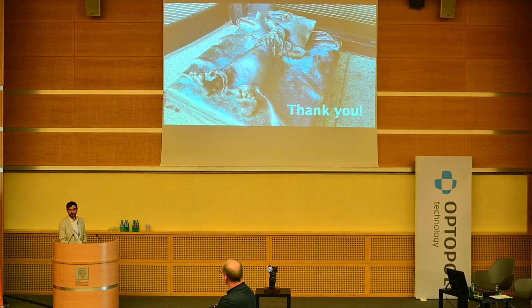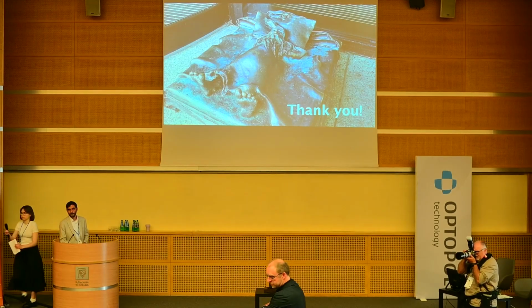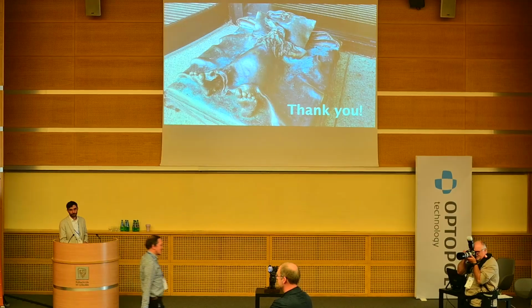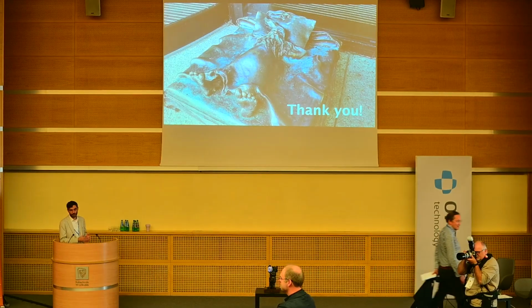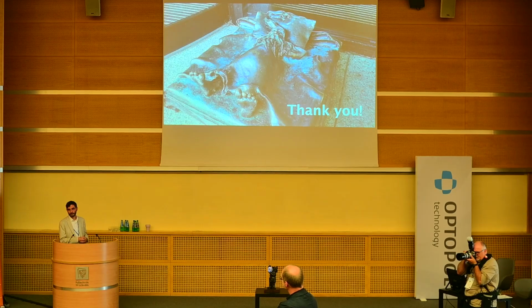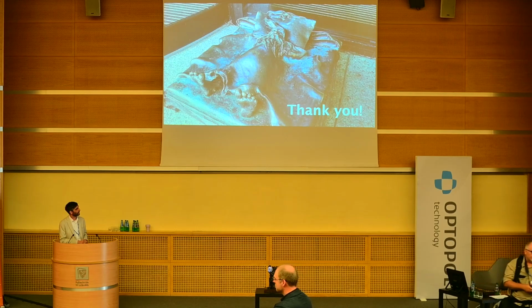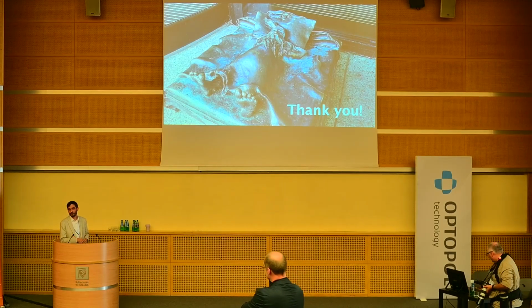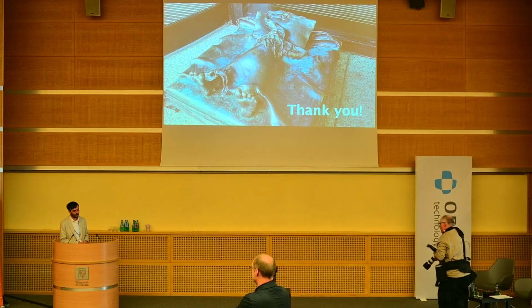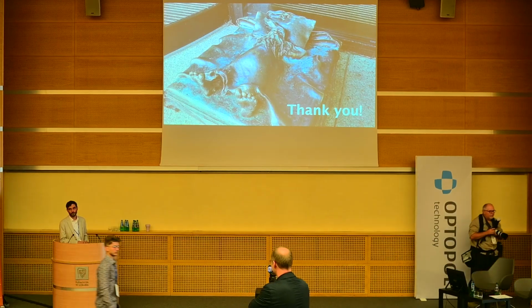Thank you for a very nice presentation. I was wondering, is staining used for any application for the OCT? So typically not, but we've done it, for example, using visible light OCT, so similar to white light microscopy, you can use the same stains to generate additional contrast. We also stained and added a fluorescence channel to OCT to get additional information, but usually it's not done. Usually you don't need contrast agents for OCT.